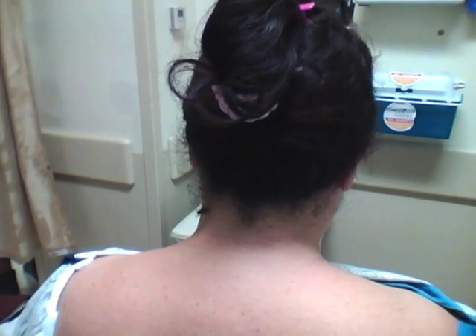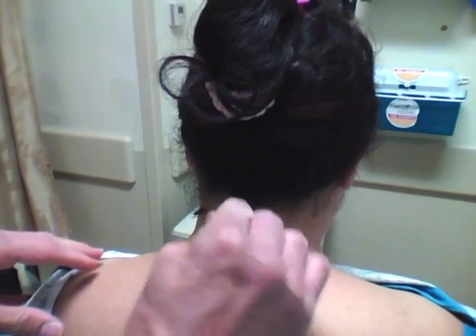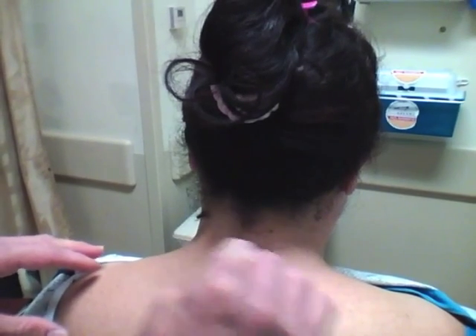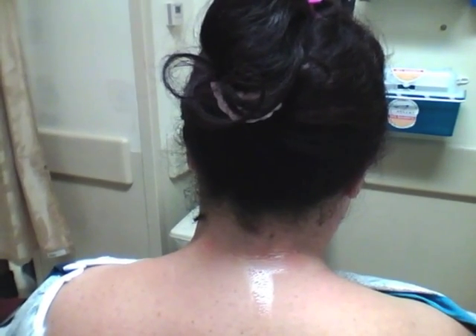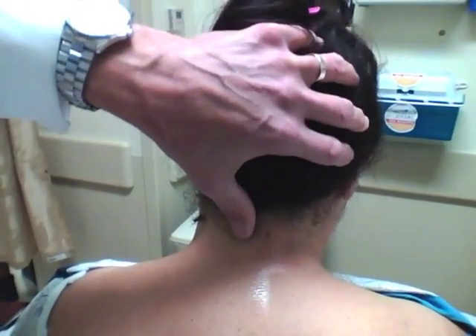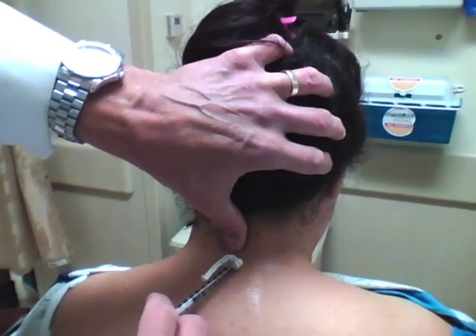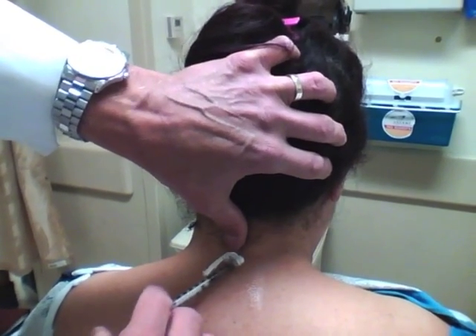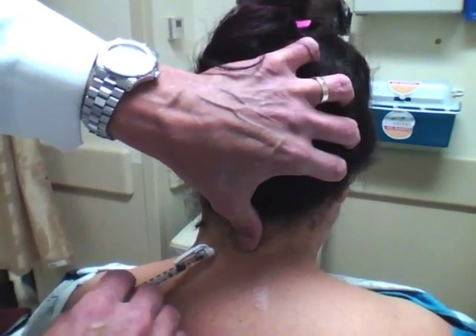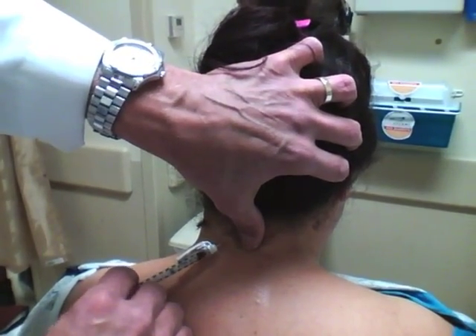The first thing we're going to do is clean her up a bit. I've already got a feel for where we're going on her and I've kind of marked her a little bit with my fingernail. Once we get her numbed up, I'm going to put a little bit of lidocaine in on either side. Here's the spinous process — this is about C7 — and a little bit off to the side, right here I'm going to raise a little wheal. We've cleaned the area with chloroprep already.